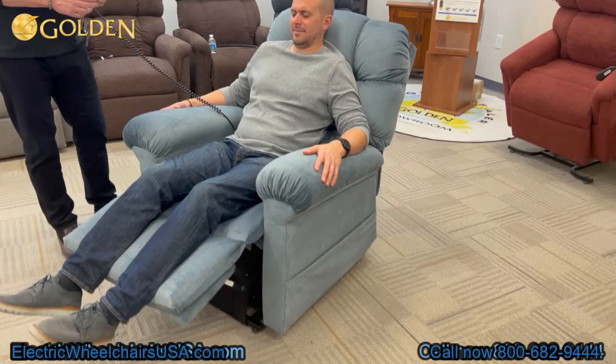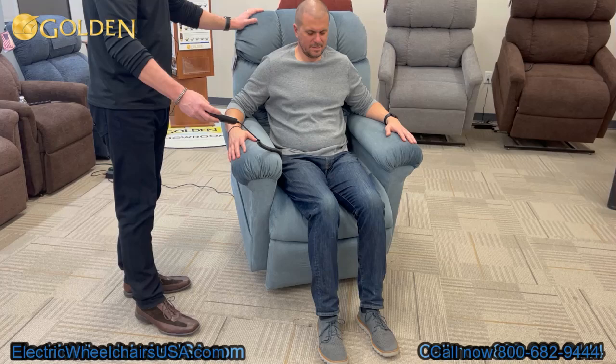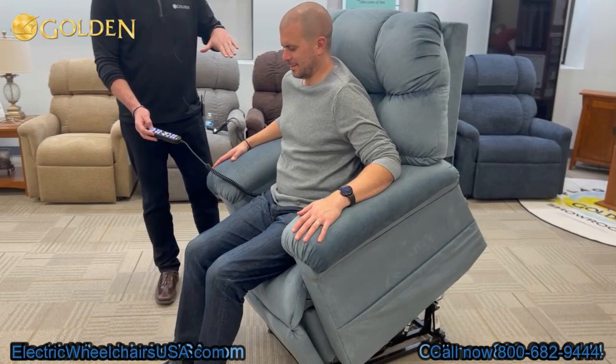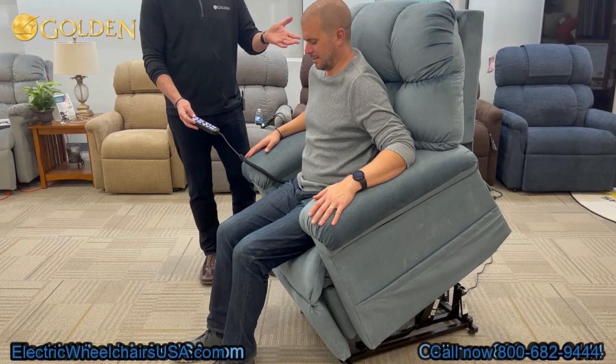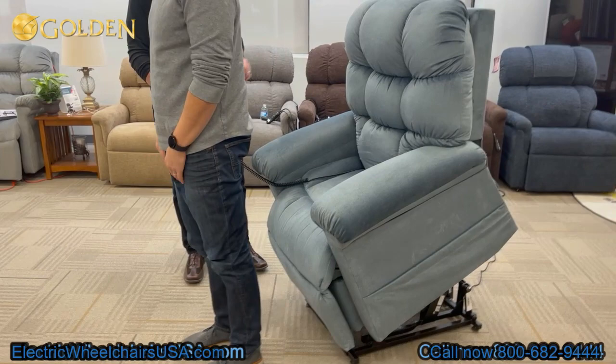The PR515 has a nice traditional look. Going into the lift position, you can see that the rear of the chair lifts first — the back actually stays open. With one button, it closes out of the rejuve position into a nice gentle lift position with a gentle angle, so you don't have that feeling of being pushed out of the chair. He's not even holding on. When he's ready to exit, he can just use his quad muscles and arms to gently move right out of the chair.